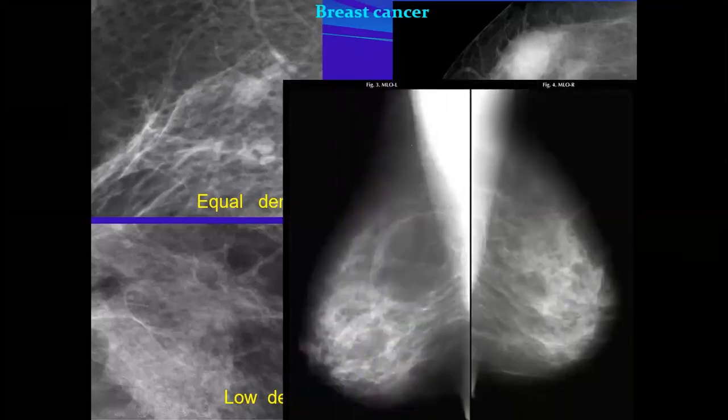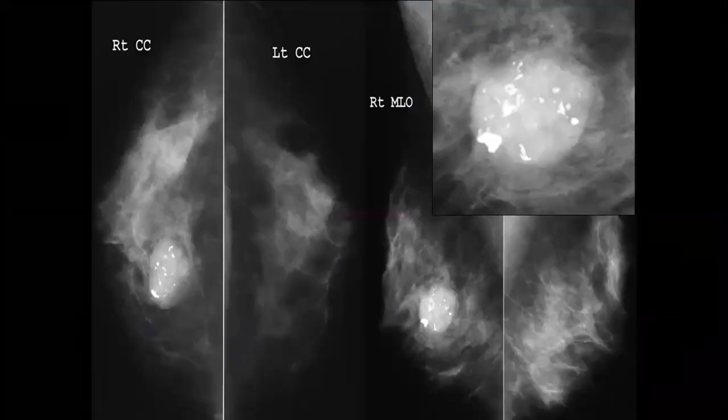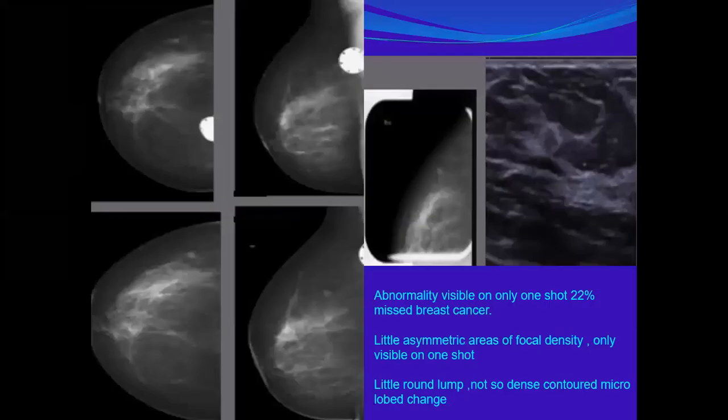And we said any fat containing mass represents BI-RADS 2, typically a benign mass. Also describe the associated features, as in this case with skin thickening and trabecular thickening in a malignancy, as well as malignant type of calcification in an indistinct mass representing BI-RADS 5, compared with this typically benign, partially obscured mass with the popcorn calcification in case of involuted fibroadenomas.